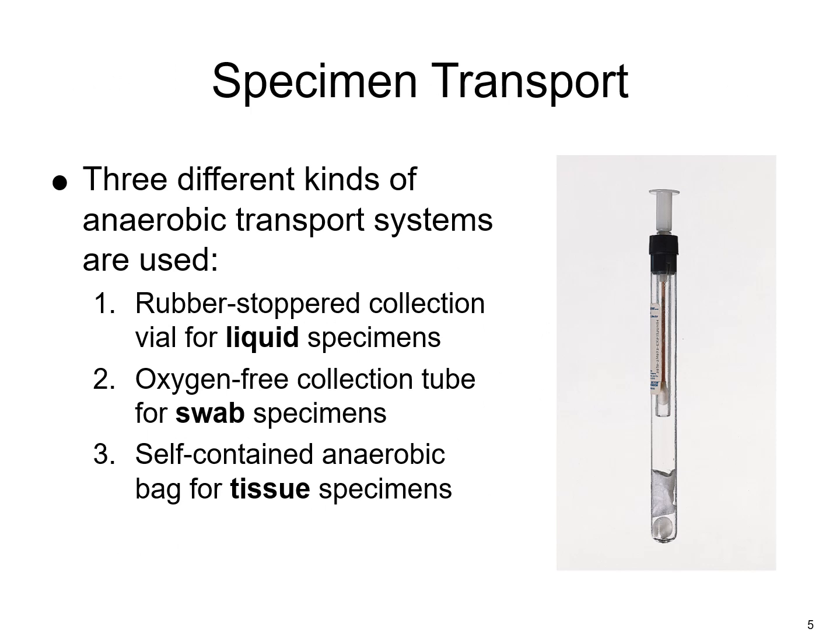So anaerobic cultures will be collected in some sort of transport system that would prevent exposure to oxygen. So obviously if you were collecting a blood culture, it would flow through the needle from the vein directly into the blood culture bottle. And aspirates are going to be contained in a syringe where there's no exposure to any sort of oxygen, and your suprapubic urine collections directly from the bladder can go directly into a vacutainer type tube.